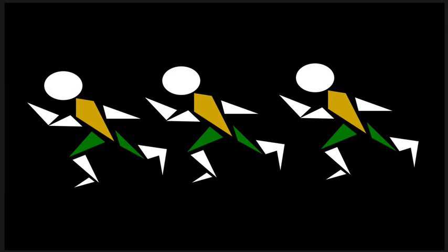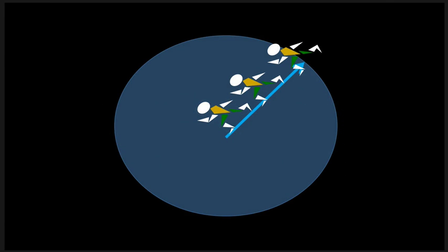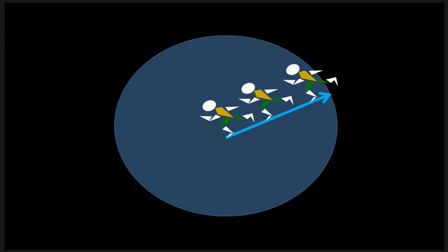So maybe a better way to think about T2 is like this. Imagine that we've got a track team here, and these guys are from, I don't know, Jamaica or Kenya or something like that. And they're three twin brothers here, identical in every way. And they're going to start on the starting line together. And they're gonna go around. Well, they're gonna stay right next to each other, right?